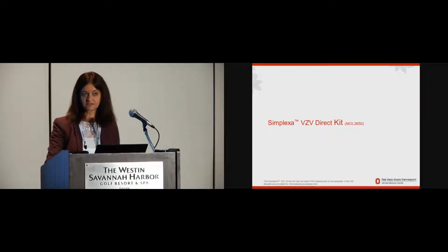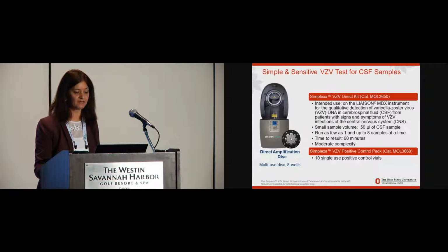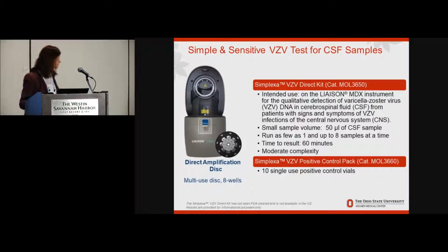So with that background, a little bit on the VZV, why it's important, and all of that, I'd like to just discuss some of the results on the varicella direct test, for which we were a clinical trial site that performed it in my lab. So again, coming to the Liaison MDX instrument, you've heard from Michelle and Jim about the standalone instrument that can do testing for a large number of analytes.